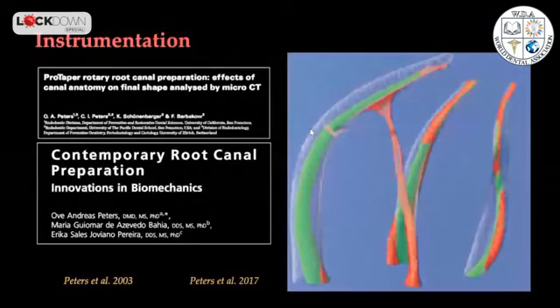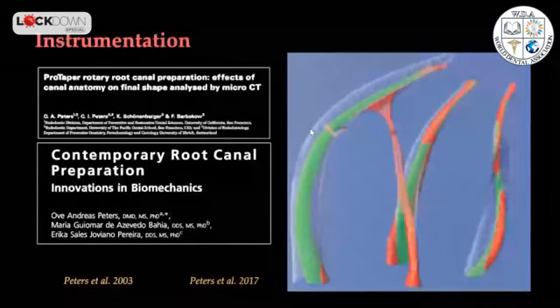But with a vast majority of the rotary or reciprocating instruments, we don't touch all the parts of the root canal wall. Like, for example, what this micro CT shows is parts of the root canal wall where your instrument touches, that is the green, and the red is where the instruments don't touch.